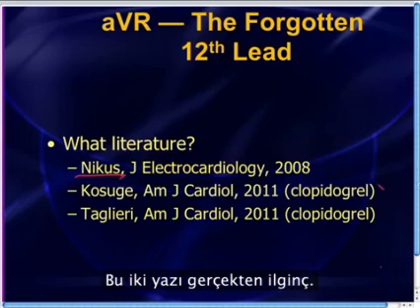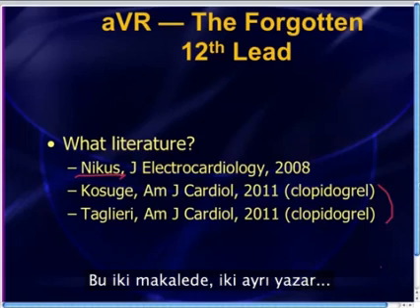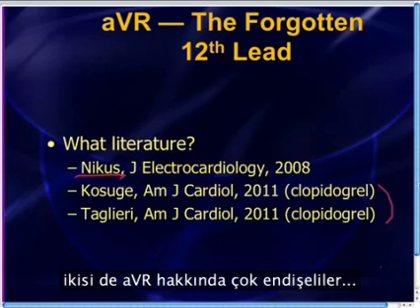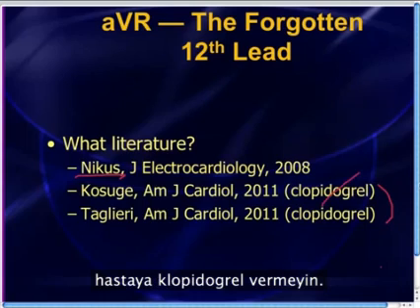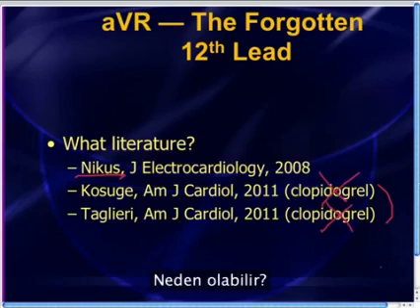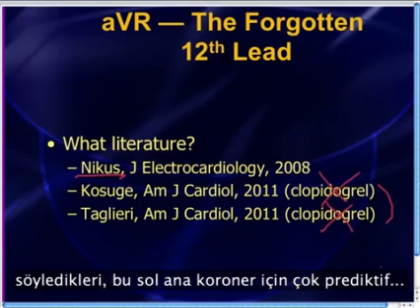And then these are two articles that are pretty interesting, both from the cardiology literature. In these two articles, these two separate authors both were so concerned about lead aVR that they actually said that if you see ST segment elevation in lead aVR, don't give the patient clopidogrel.